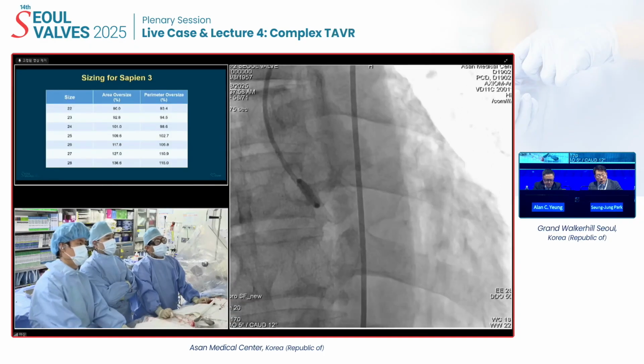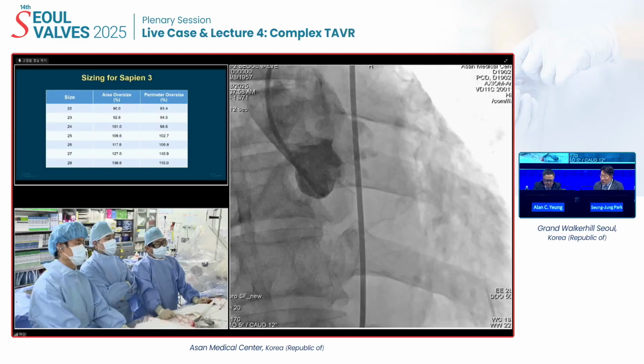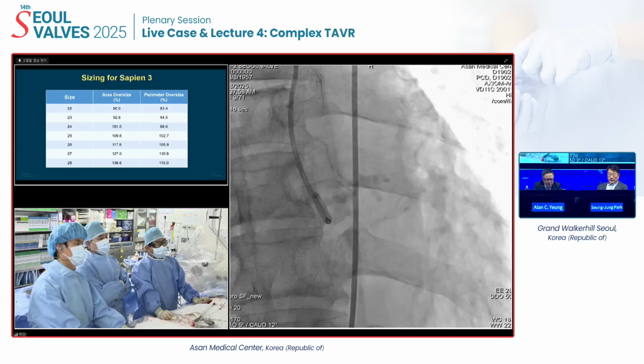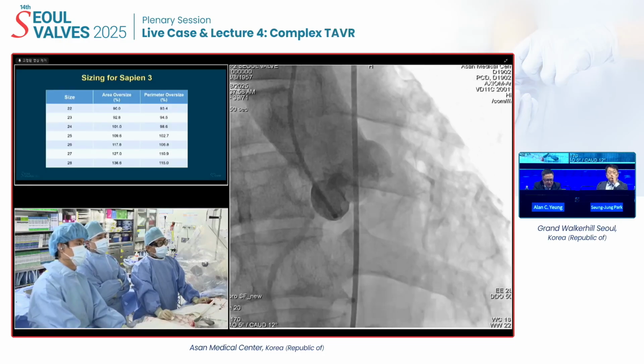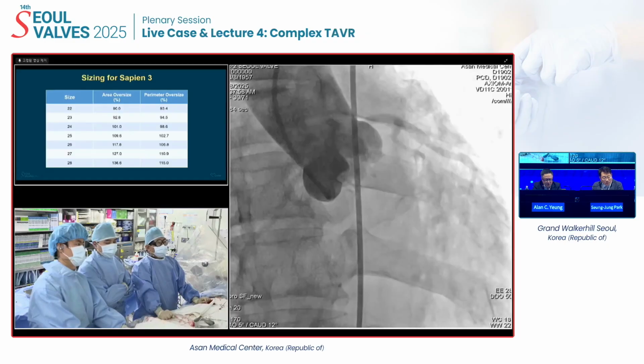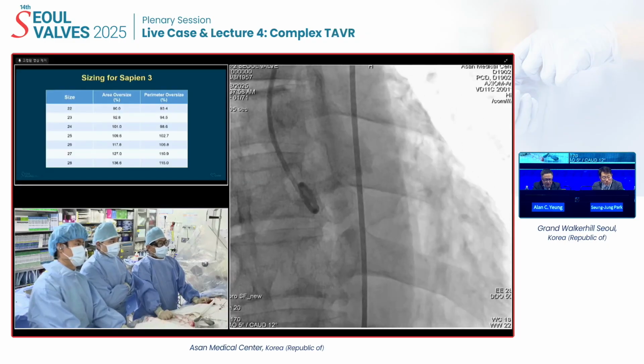And 5% means important undersizing issues, right? And then there's a raphe as well, meaning that the fused raphe is calcified. So that also doesn't matter as much size-wise, but any oversize will poke that out as well. Great.